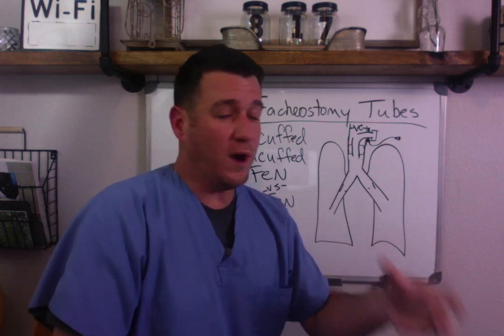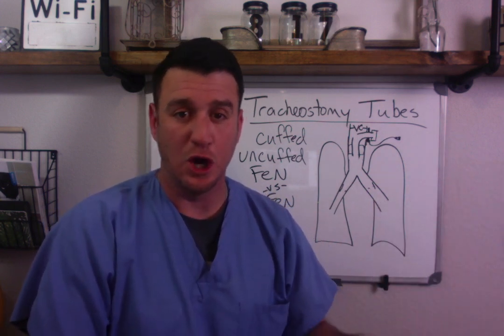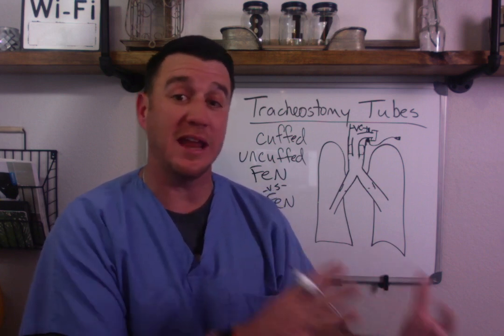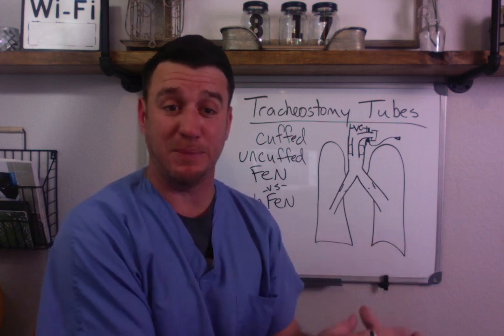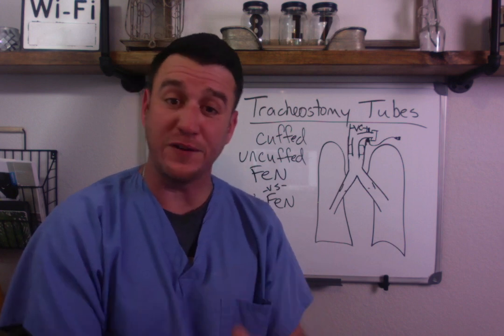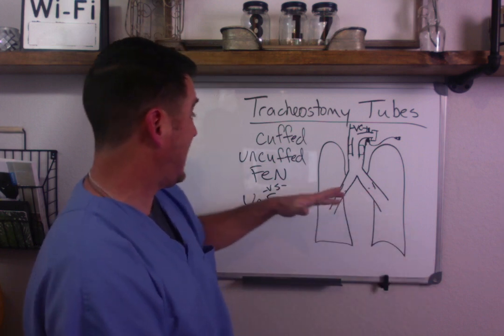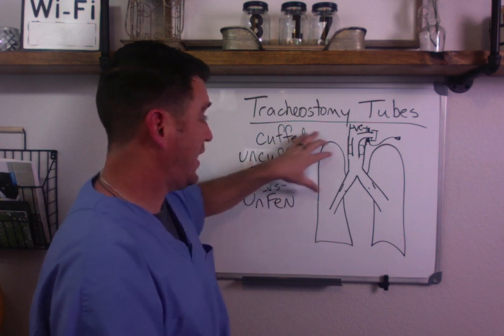What if you have a patient who requires mechanical ventilation at night, but during the day they're off the vent and they go onto a speaking valve, which is my next talking point? If that's the case, then a fenestrated tracheostomy might be the best choice for you. But you have to understand that you have to have a cuffed and fenestrated trach.